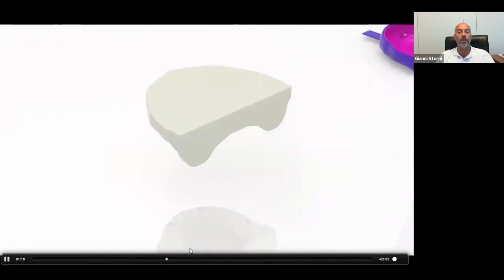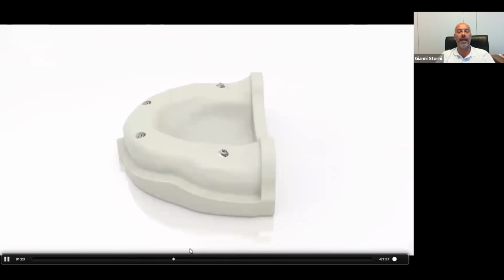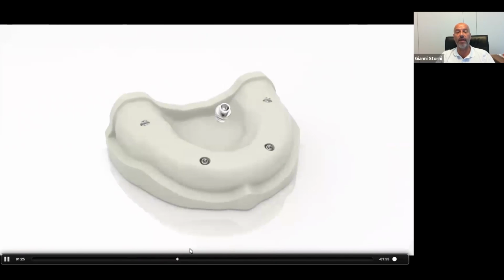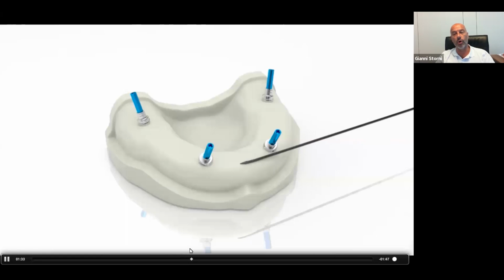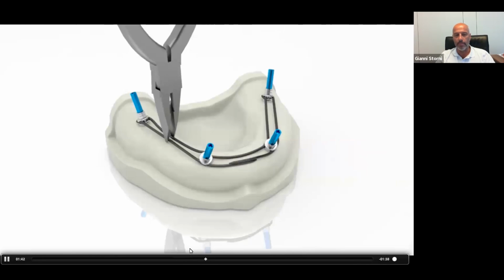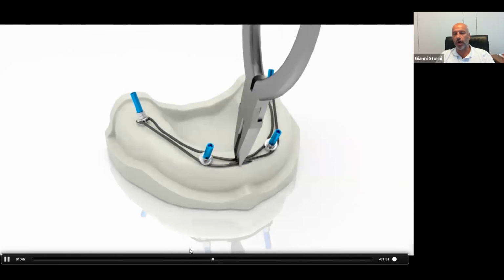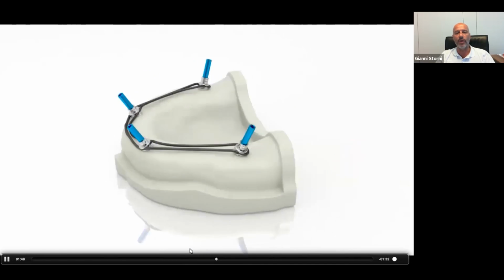But now, in the immediate loading in the lab, we need to create an abutment and a very fast reinforcement using one specific abutment that has two holes. We use a titanium wire that in the lab we connect to each other in 10 minutes. We bend it with our tool, add a drop of composite, and we are ready.